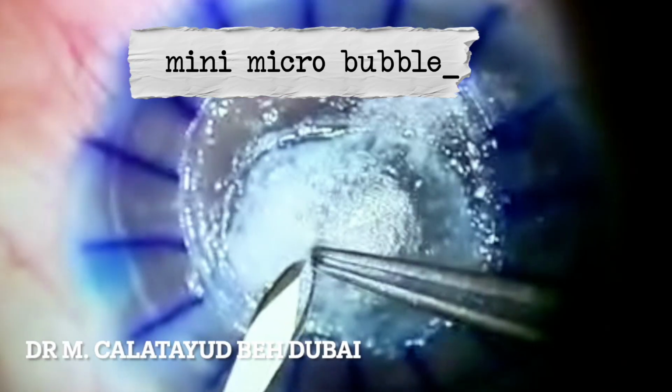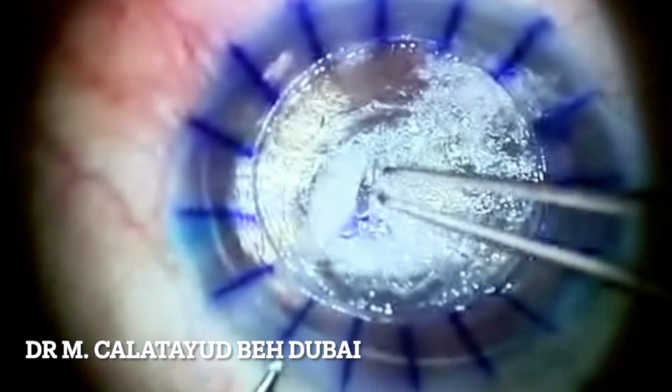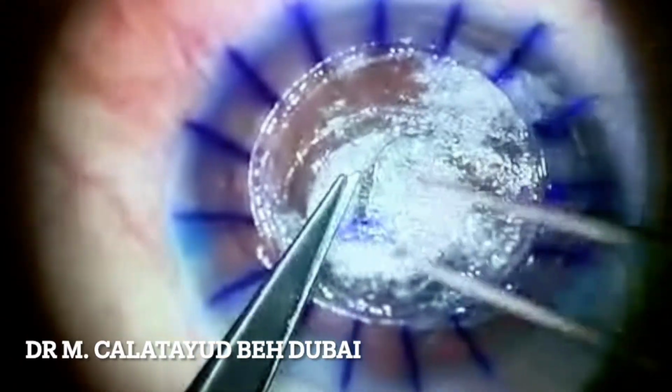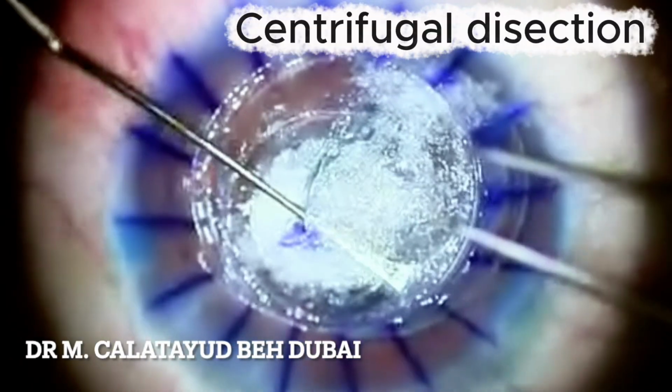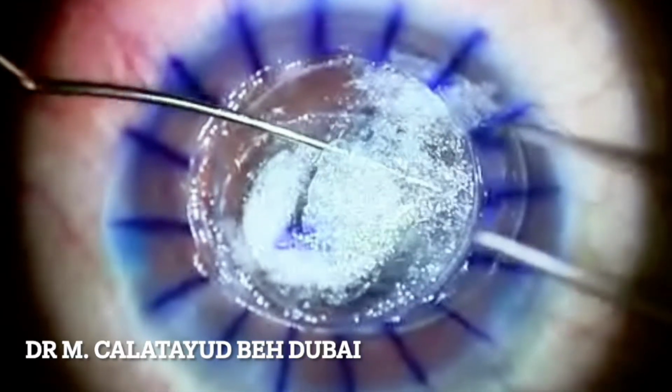As soon as we see the bubble progressing through the periphery, we stop injecting, because we don't want to reach the incision axis, as there is a break in Descemet's membrane there caused by phaco. This mini microbubble reached the plane we were looking for, so we have to take advantage of it.